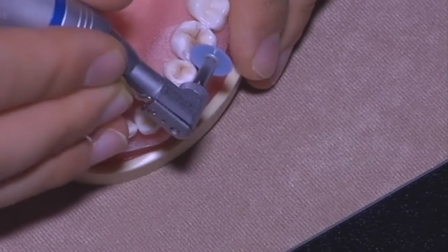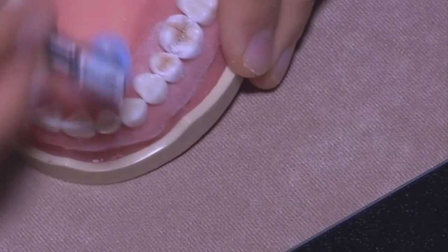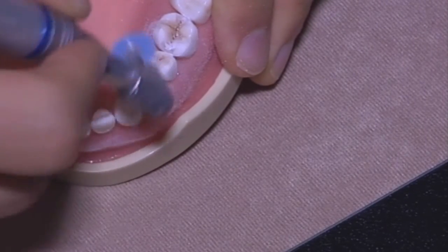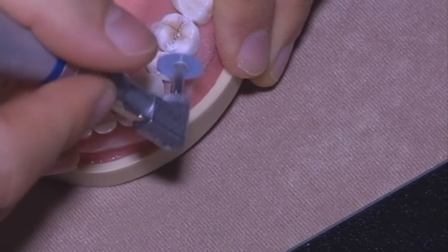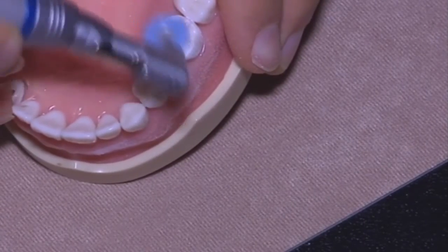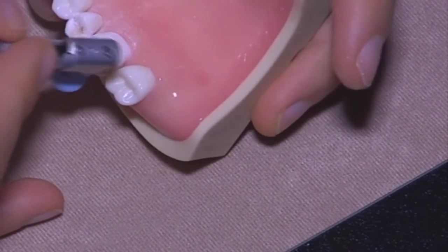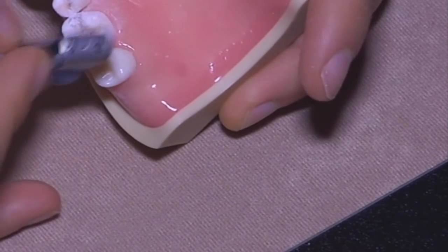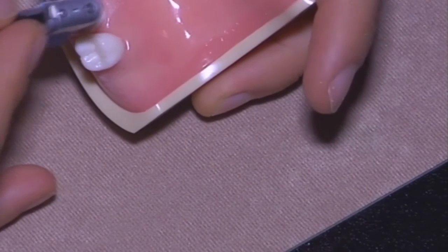That's why the handpiece must work slowly. You don't have to have a full pressure on your foot control, otherwise you're gonna open the contact point. And this is the only thing that patients understand on their posterior restorations, if the floss goes in within the contact point.